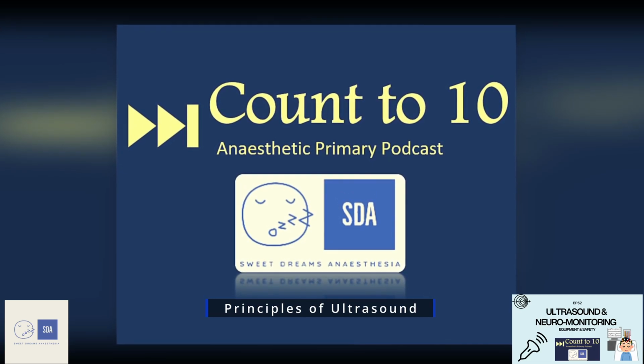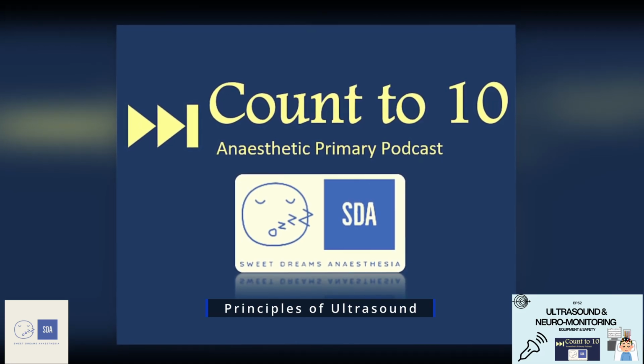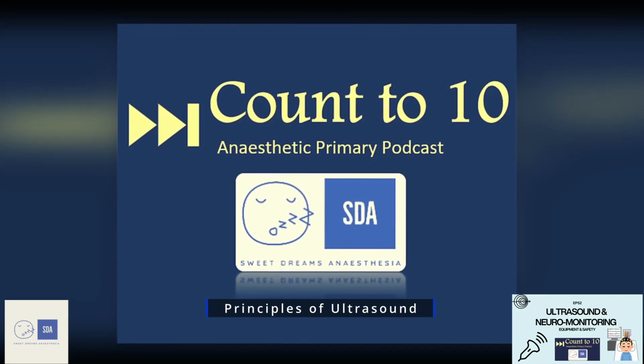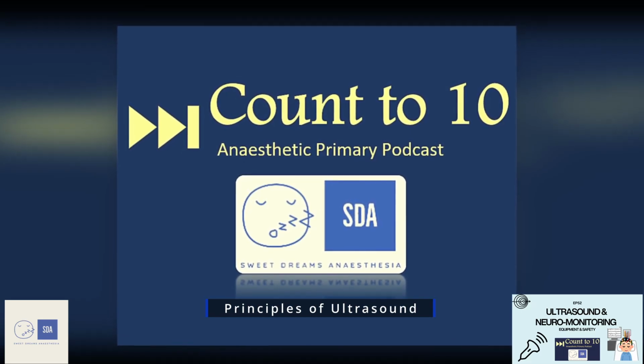The first example is the ultrasound probe floating in air. Air has an extremely low density, and therefore the acoustic impedance of air is essentially close to 0. This leads to a huge difference between acoustic impedances where any one boundary is air. And that's why we refer to air being the enemy with an ultrasound probe. This is also the reason why you need to put gel on your ultrasound probe, is to get rid of air as the medium so we can actually generate an image when we place that ultrasound probe on the patient.